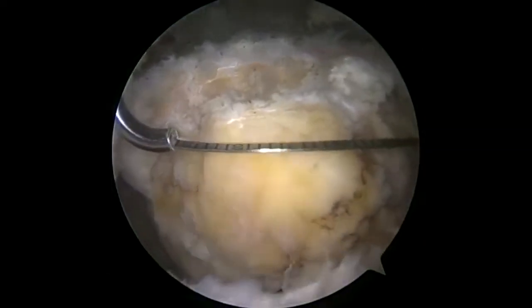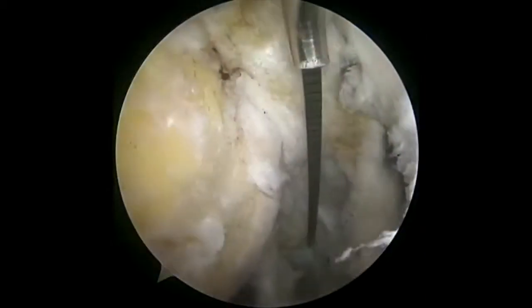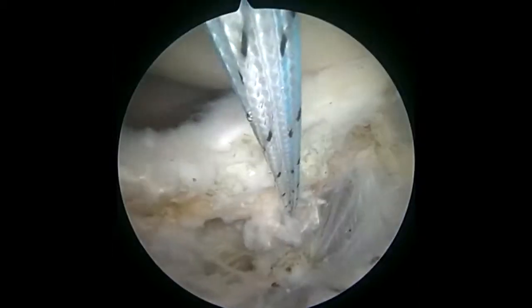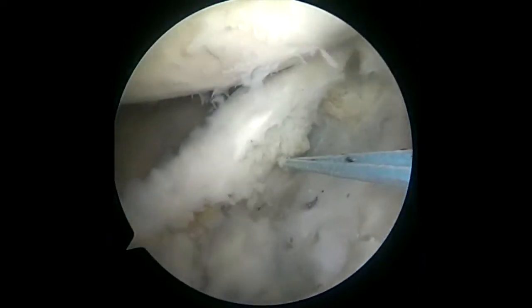The dimensions of the future graft size are measured. The medial-lateral and superior-inferior distances are measured. Two single-loaded anchors are placed in the glenoid neck, one at the inferior portion of the subscapularis remnant, and the second is placed at the top of the subscapularis remnant.